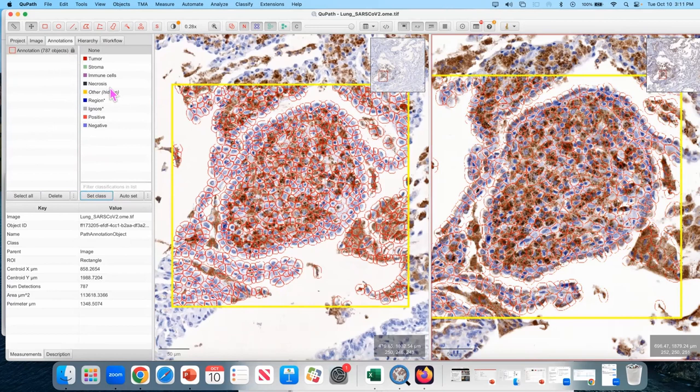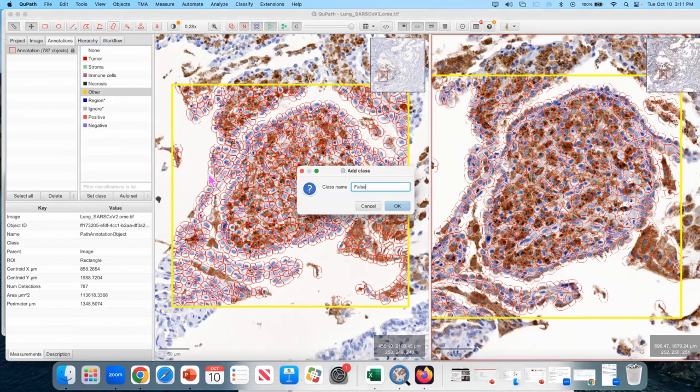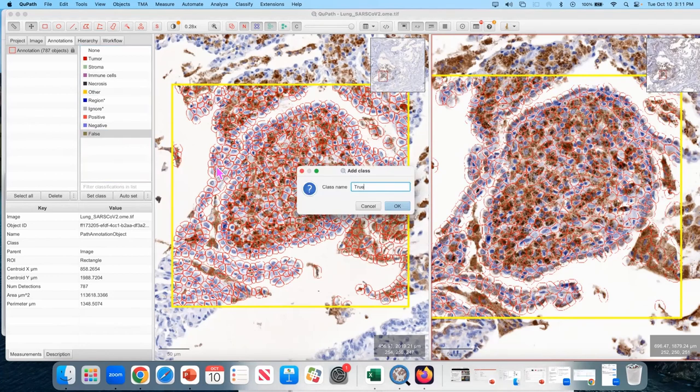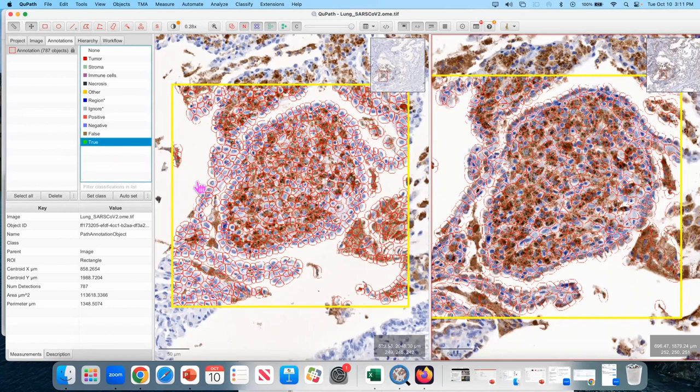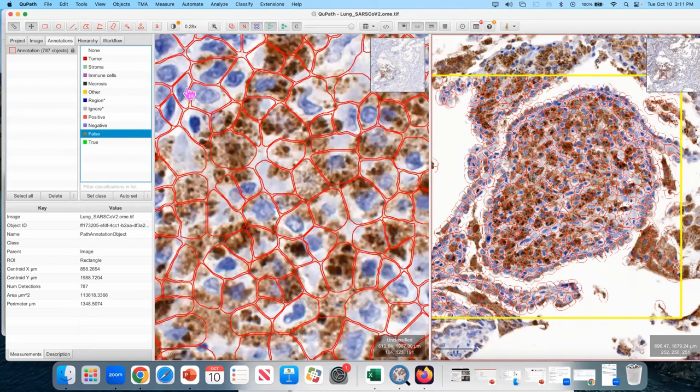So paying attention to what's happening, and also, if you're working on a very different project, you may wanna start QuPath from scratch. So I know that everything that's here is an artifact. So I can add class false, and I can add class true. Okay, so I'm only gonna annotate the cells that are false positive. I'm gonna leave these guys alone. They did nothing wrong, okay?